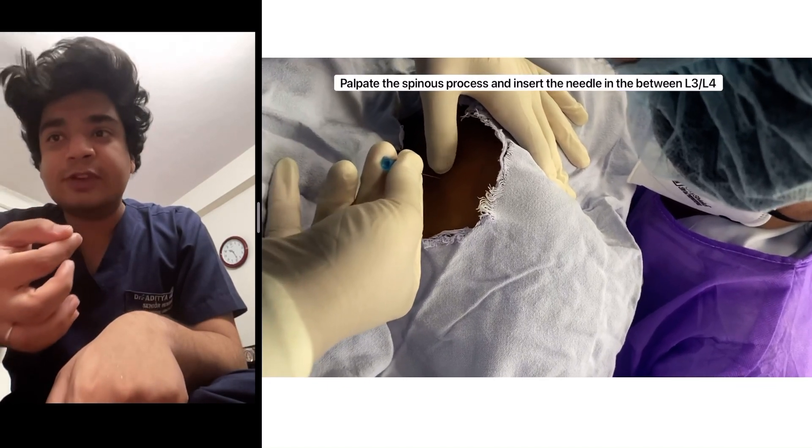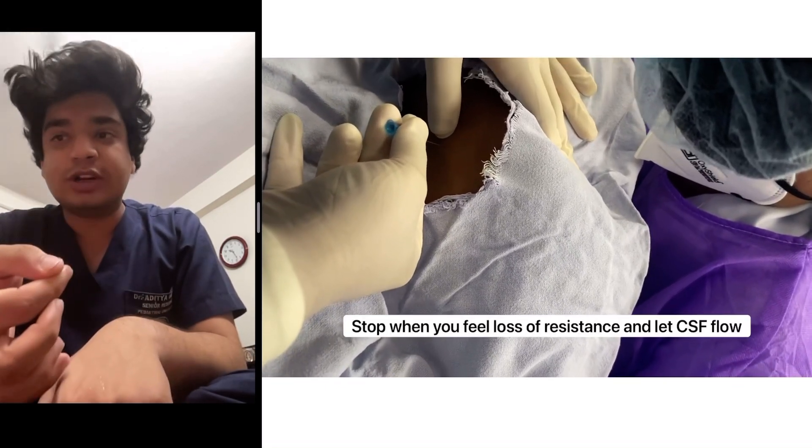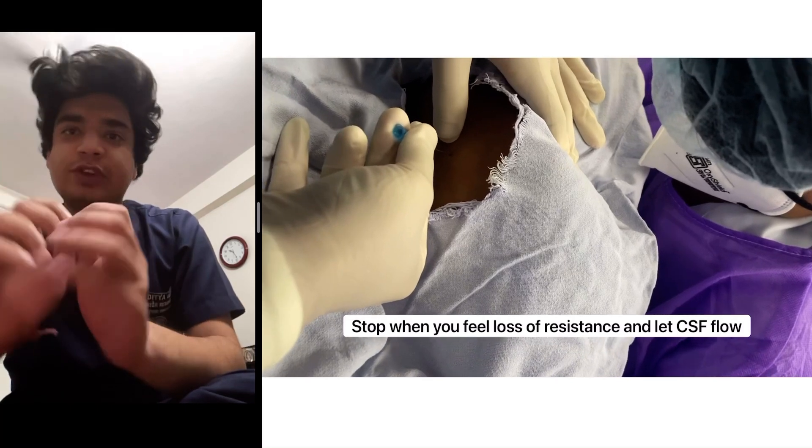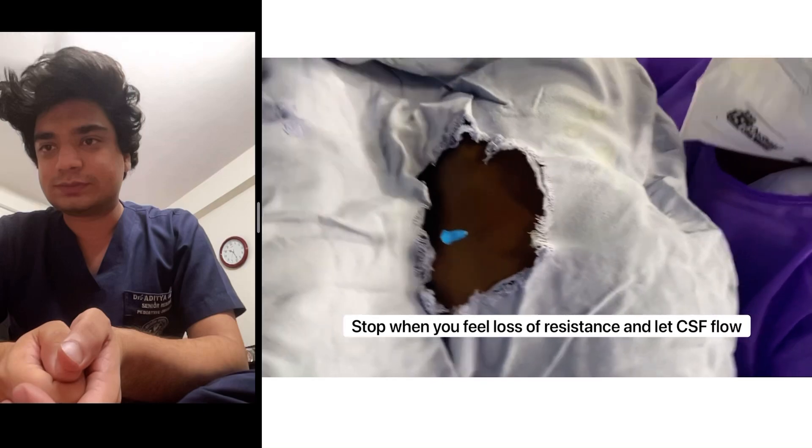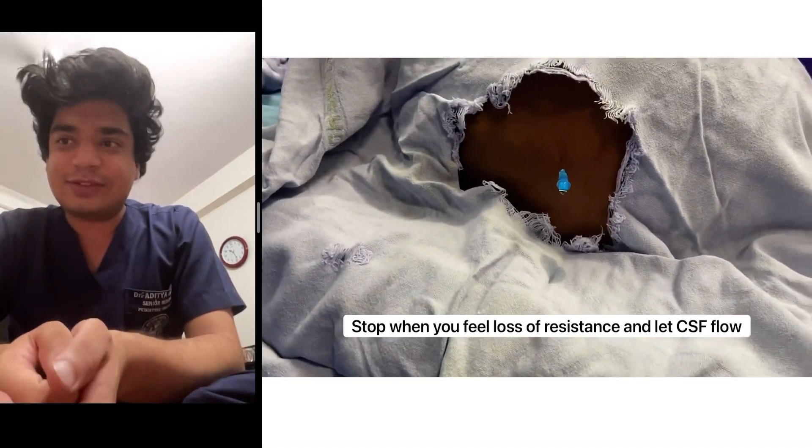Slowly insert the needle with the bevel up, pointing towards the patient. Stop when you feel the loss of resistance and let the CSF flow. That is the CSF that we can see.